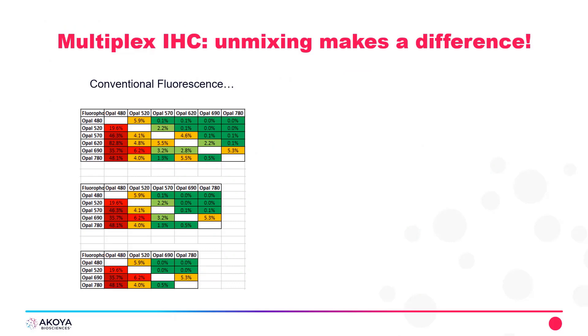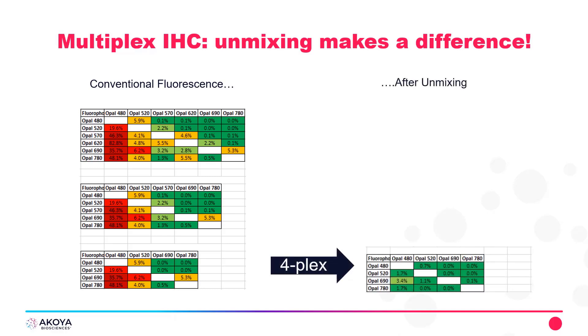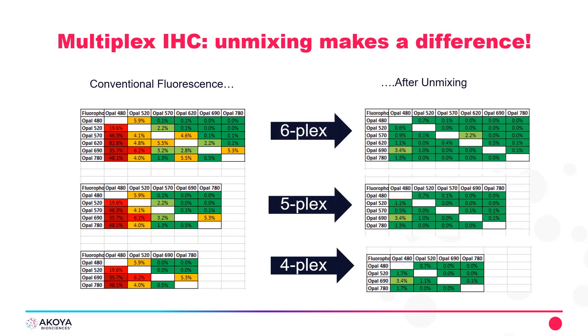Here's the conventional fluorescence, and you can see the bleed-over shown by high percentages — some highlighted in red and some in yellow — from conventional fluorescence systems. With Akoya Biosciences, we perform spectral unmixing to alleviate that bleed-over so that we can characterize six markers or seven colors in a tissue by imaging the whole slide without spectral bleed-over. You can see there is a massive difference between the purity of signal after unmixing and that of a conventional fluorescence system.